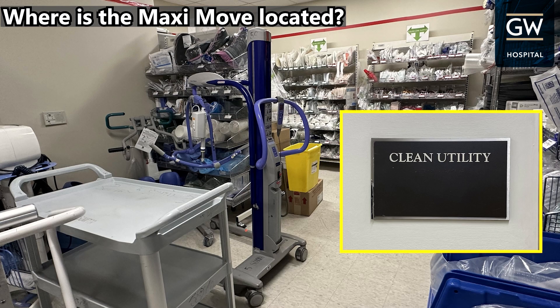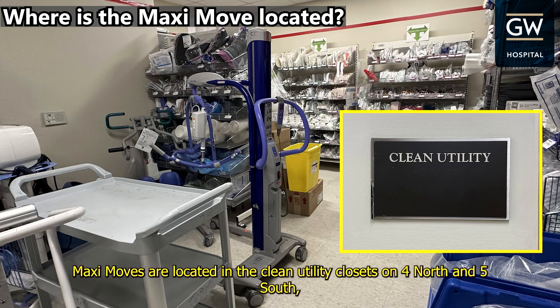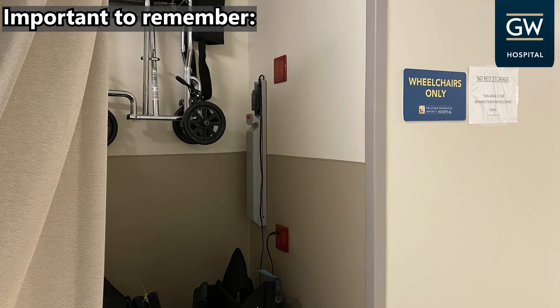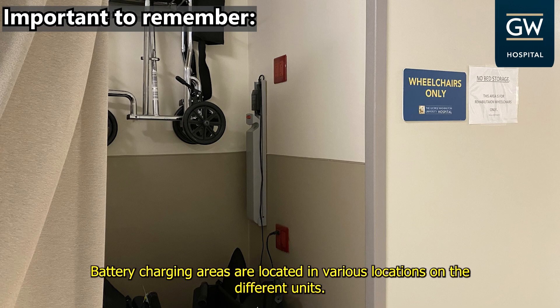Where is the MaxiMove located? MaxiMoves are located in the clean utility closets on 4 North and 5 South, and in the equipment room on 6 North. Important to remember: battery charging areas are located in various locations on the different units.